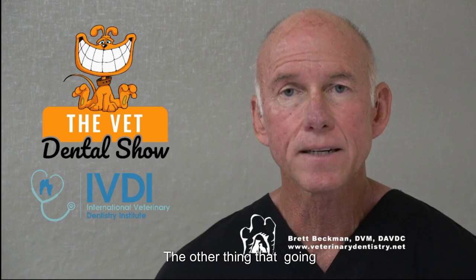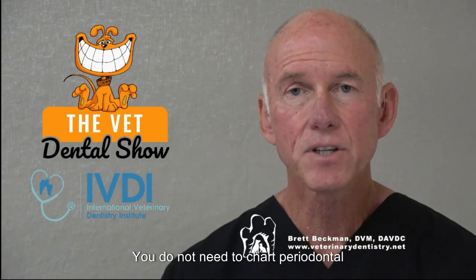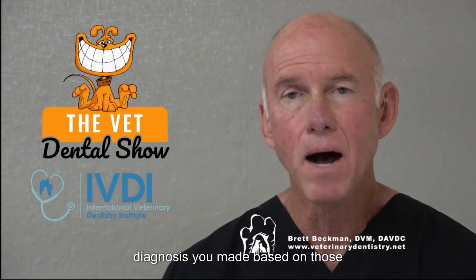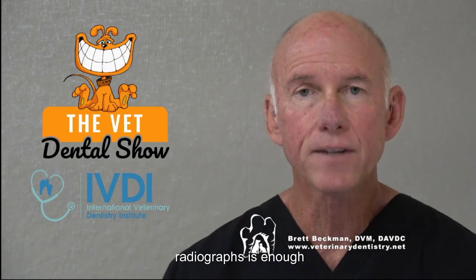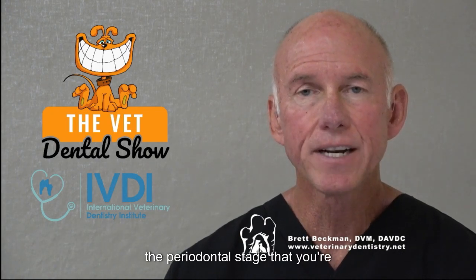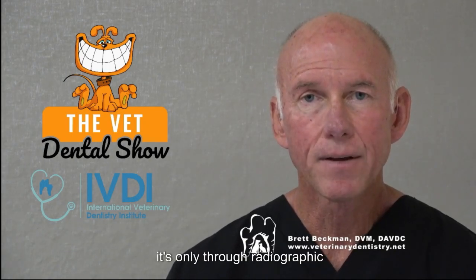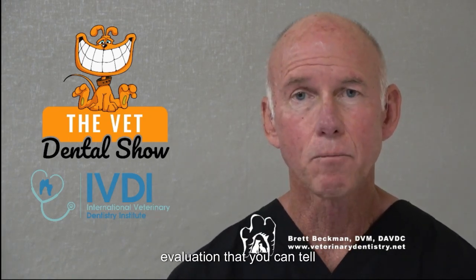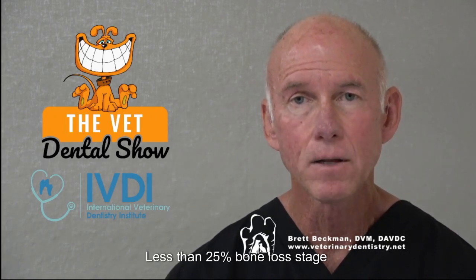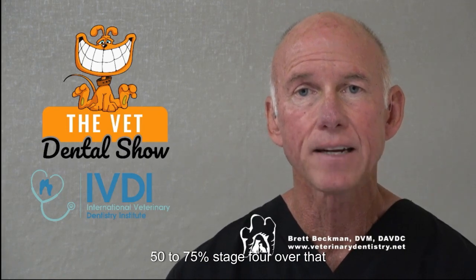The other thing that is going to save you time in that whole process of cleaning, evaluating, and charting, you do not need to chart periodontal pocket depth on the teeth you are going to extract. The diagnosis you made based on those radiographs is enough to dictate the periodontal stage that you're dealing with. And the periodontal stages are not something you see grossly. It's only through radiographic evaluation that you can tell that it's stage 1, less than 25% bone loss. Stage 2, 25 to 50%. Stage 3, 50 to 75%. And stage 4, over that.